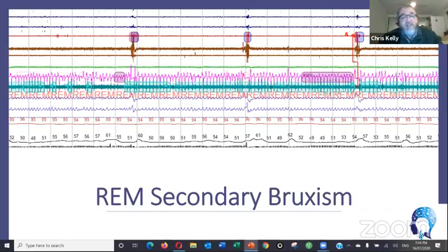Then they travel along for about two to two and a half minutes, and then there's another increase in pulse rate. Their heart is beating faster. They have the three breaths again. There's the phasic interlude, and you've got your arousal just prior to that, so close that they almost look like they're overlapping.